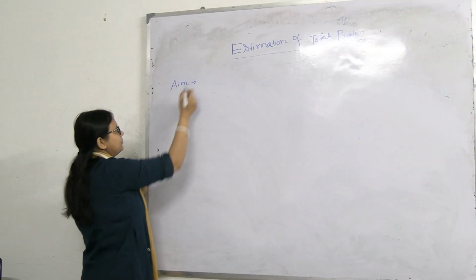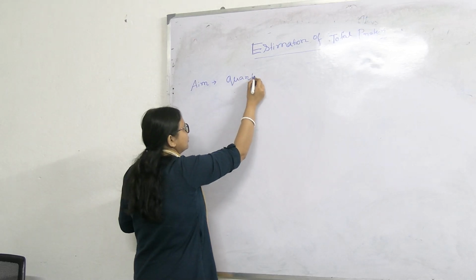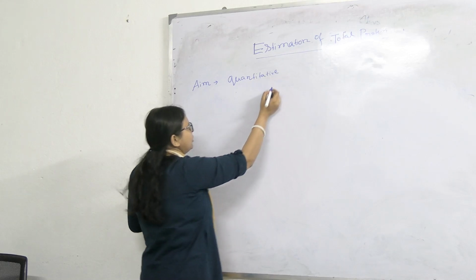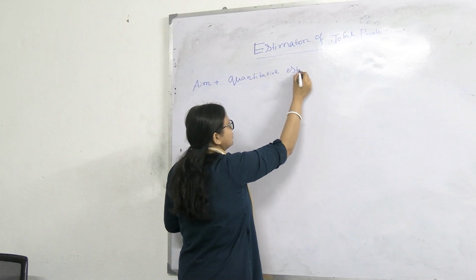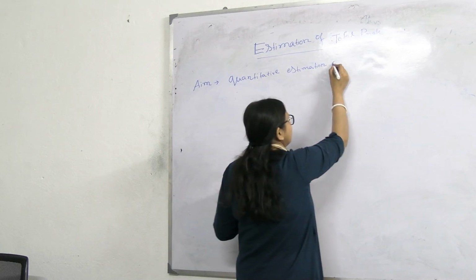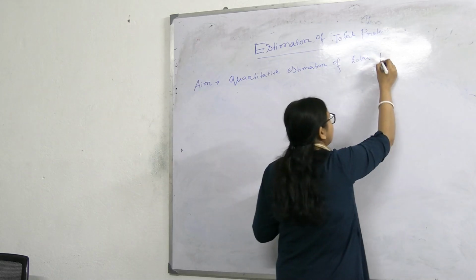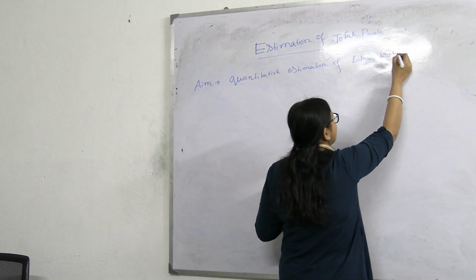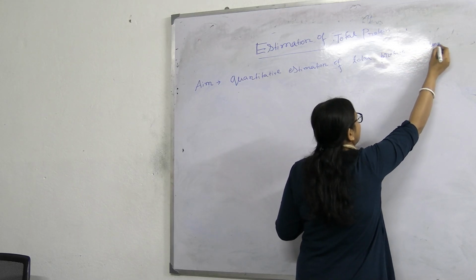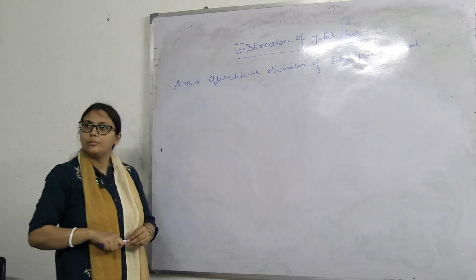So what is our aim? Quantitative estimation of total protein in blood.